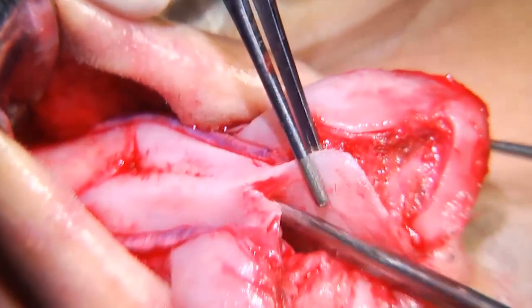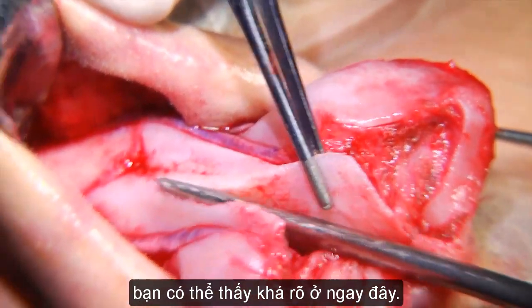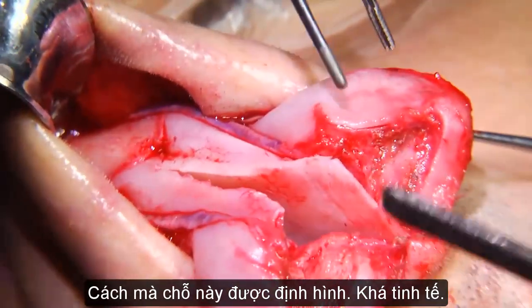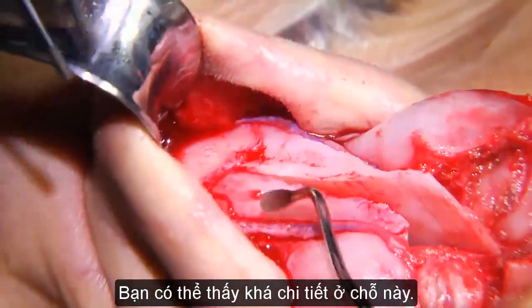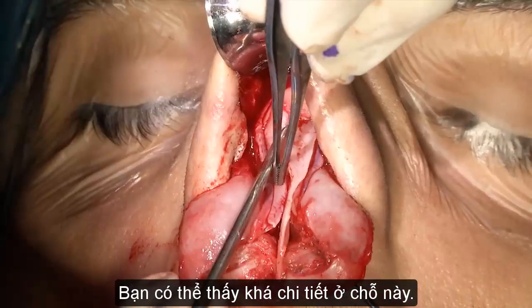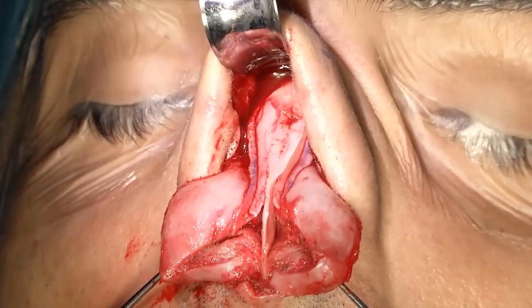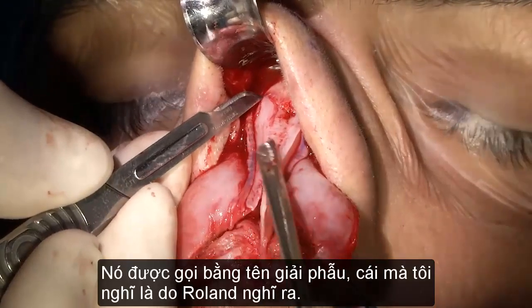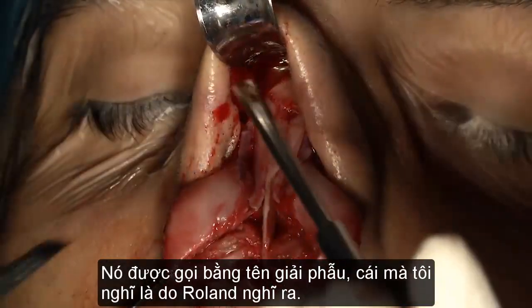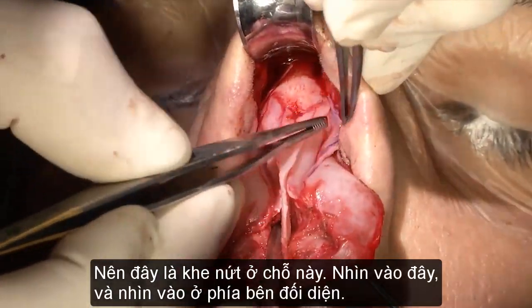So, you can actually pretty well see here the way this thing is shaped. So that's a septal T. You can actually see, look here in detail, how this bulge was the upper lat bulging in a cleft. It has an anatomical name now, which I think Rowland devised. So there was a cleft here. There's always a cleft. Look at this, all right? And look at this on the other side.